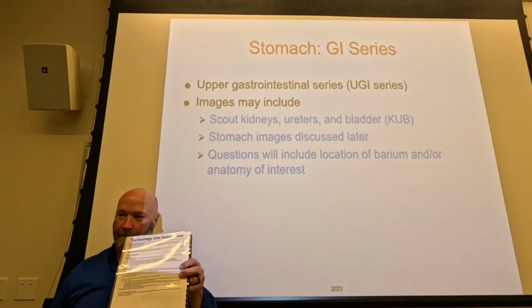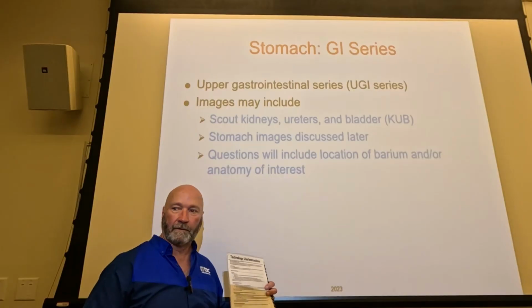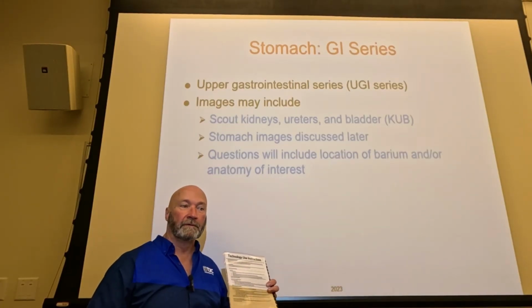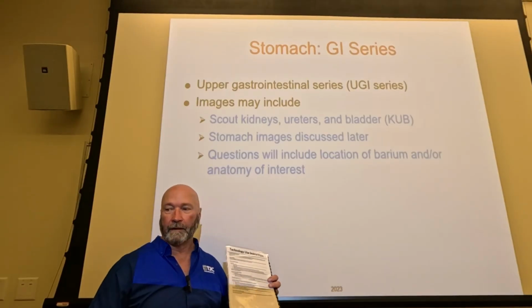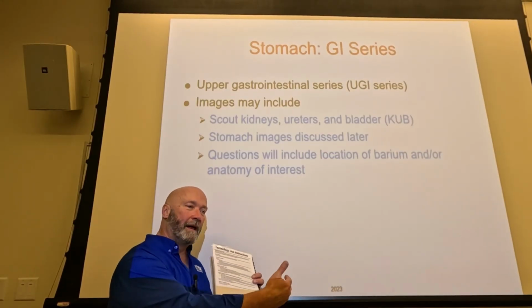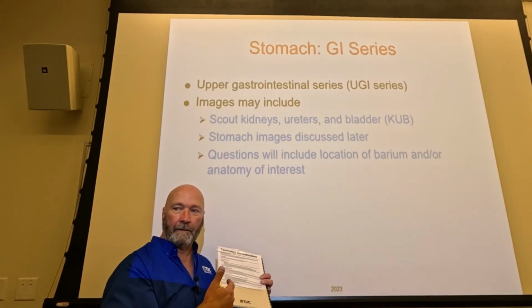So if my stomach is like this, and I turn into an LPO, where's the barium still going to be? The fundus. So I might have more barium. I probably will have more barium on the.